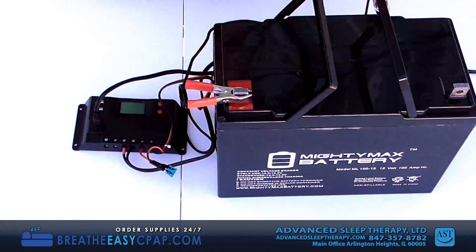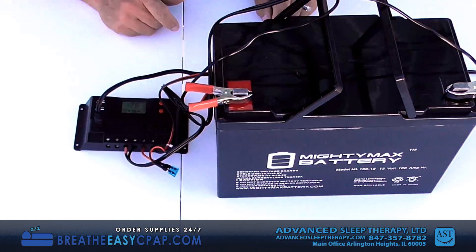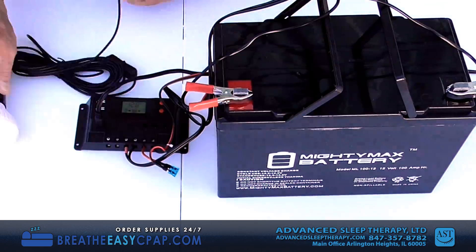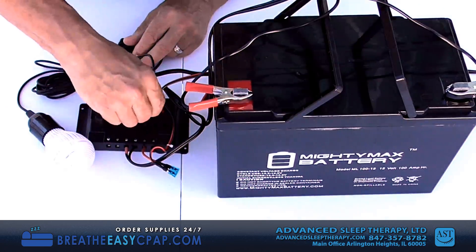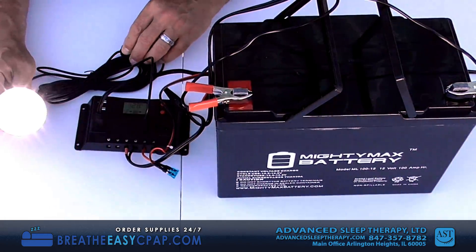Attach the battery clamps to the battery. You will see the controller start in the normal mode. The enclosed manual will show you all of the modes, but for this demonstration and almost always, you will use the normal mode. You can test it with the enclosed light bulb.